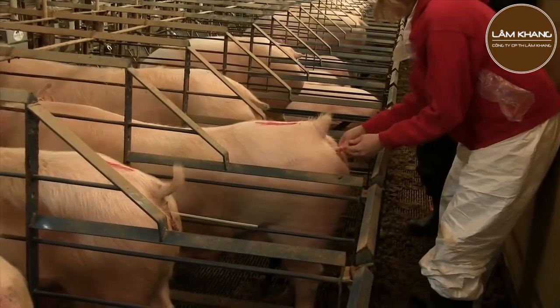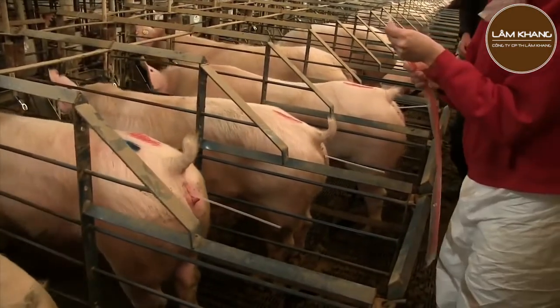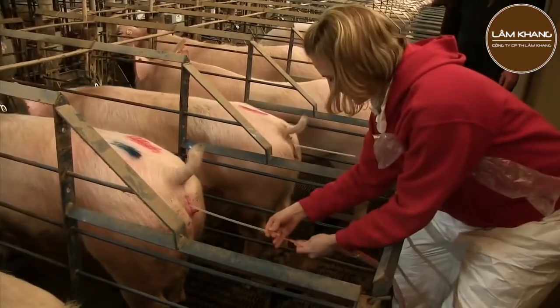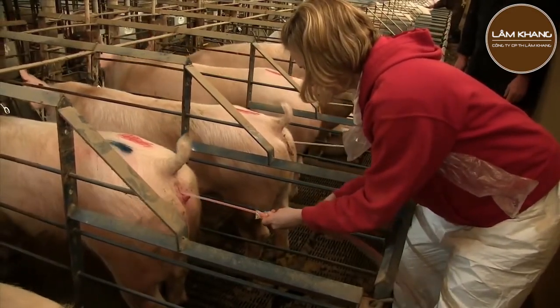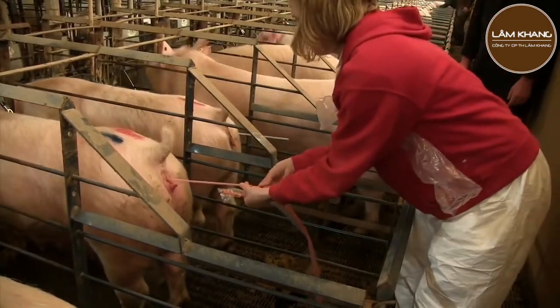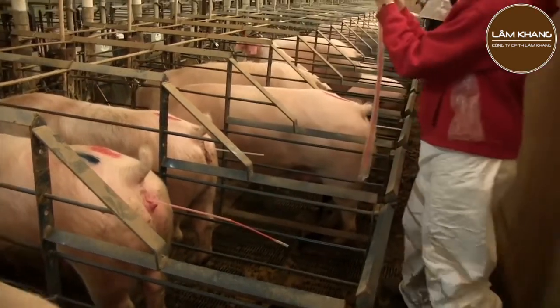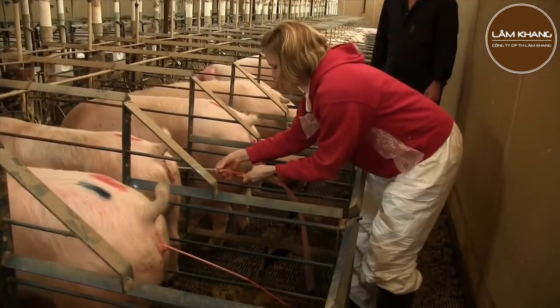Next, I will load the inner catheters into the outer catheters. Caution should be taken to not contaminate the tip of the inner catheter that will enter the uterus. As you can see, I leave the inner catheter in the plastic wrap while loading the first third of the catheter into the outer rod to avoid contamination. I'm only inserting the inner catheter to the point where I feel it reach the end of the foam tip of the outer catheter. I'm going to repeat this procedure on all 3 of the sows.